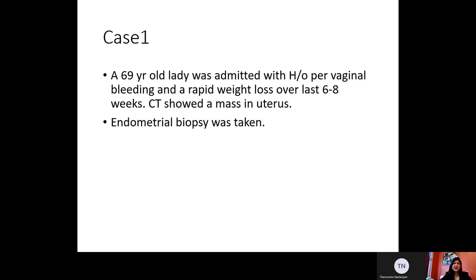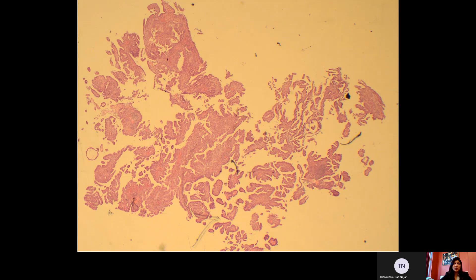Our first case is a 69-year-old lady who was admitted with history of pervaginal bleeding and rapid weight loss over the last six to eight weeks. CT scans showed a mass in uterus, and an endometrial biopsy was taken. This picture shows a low-power view of a papillary tumor with broad fibrovascular cores and cellular budding.